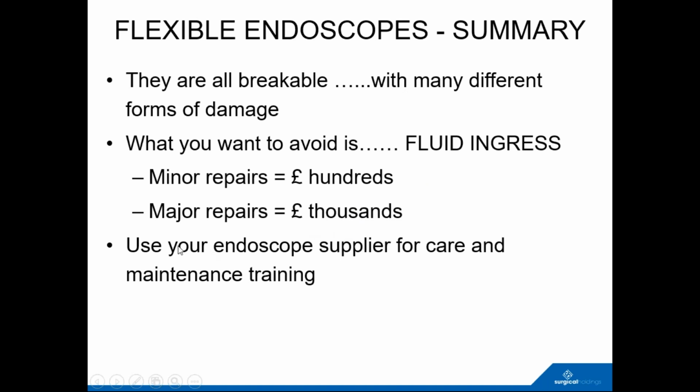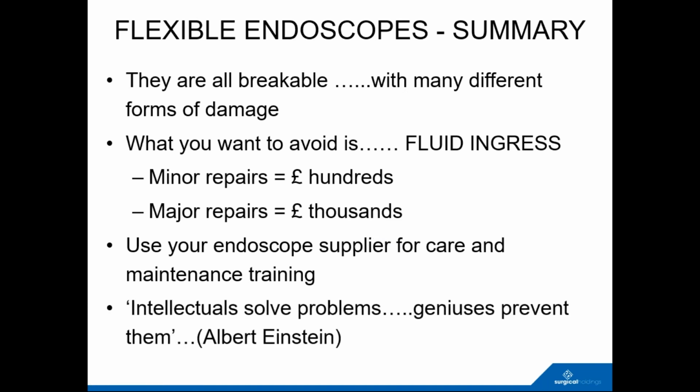Another key takeaway is to use your endoscope supplier for care and maintenance training, and that will help you prevent those expensive repairs. And the last thing is a quote that I've used before: intellectuals solve problems, geniuses prevent them. It's really about prevention of expensive repairs, and it will save your unit a hell of a lot of money on their revenue budget. And that's it.